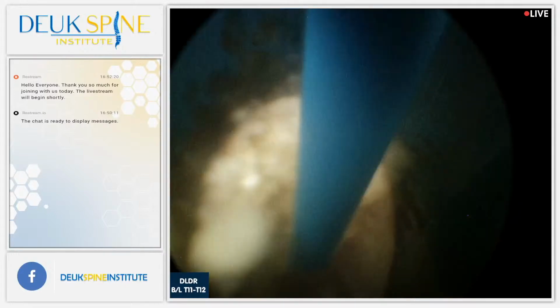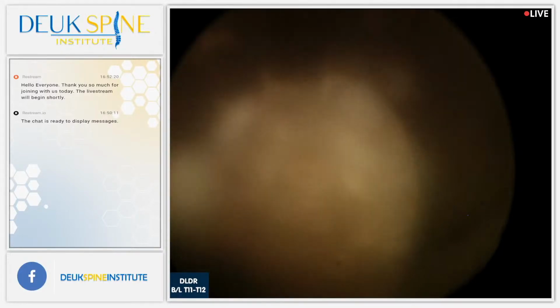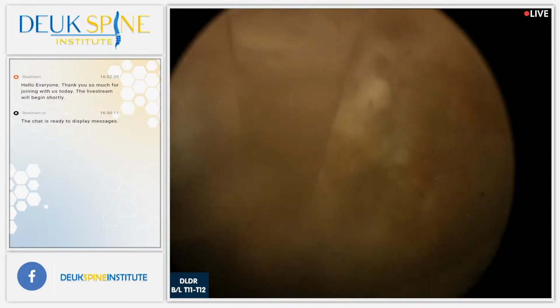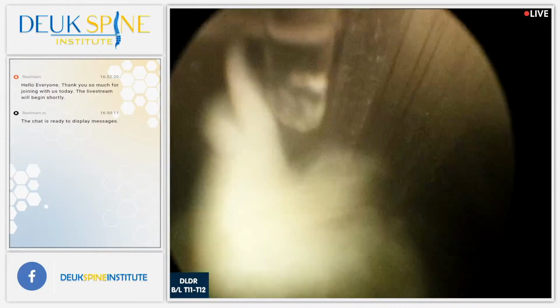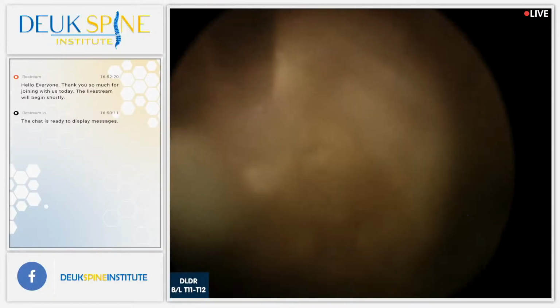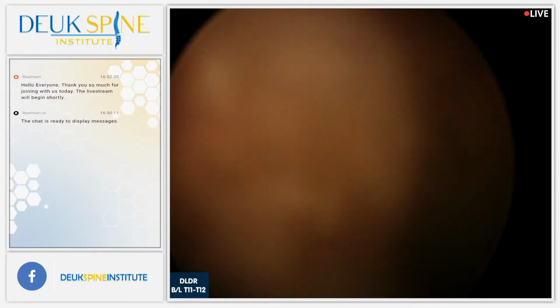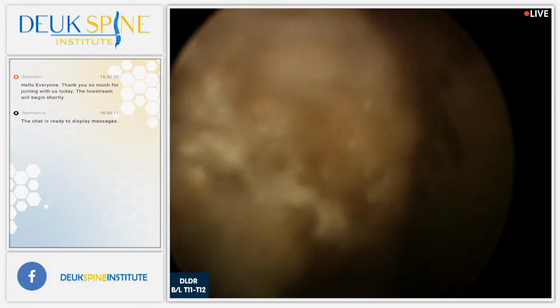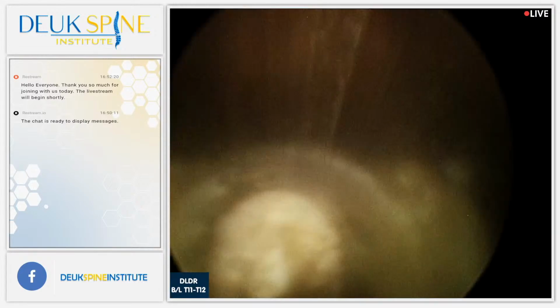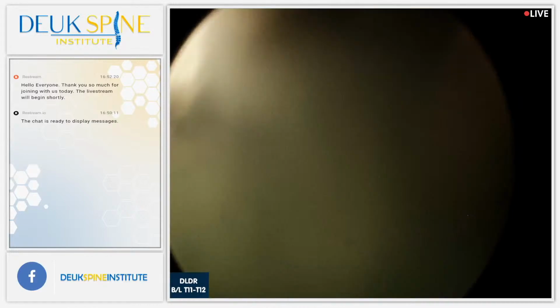Okay. Well, that's pretty much it. I can get a little bit more here. But it's calcified. It's pretty calcified herniation. Not entirely calcified, but this part of it has a lot of calcium, making it rock hard. It's really hard to get rid of it. And that's really what makes it so hard to visualize for you guys: the bleeding. Not a lot, very little, but when you're looking through an endoscope, any amount of bleeding is significant because it obscures your view.